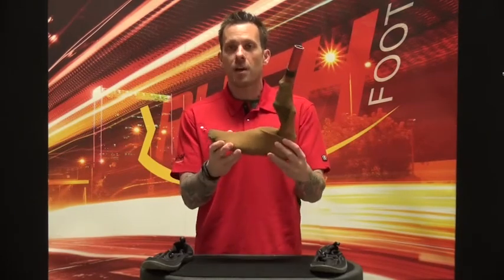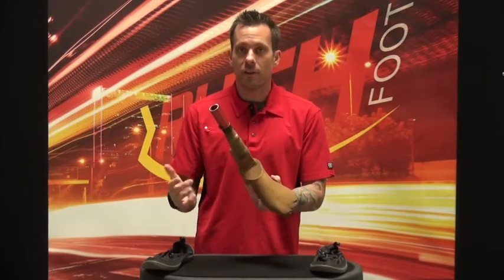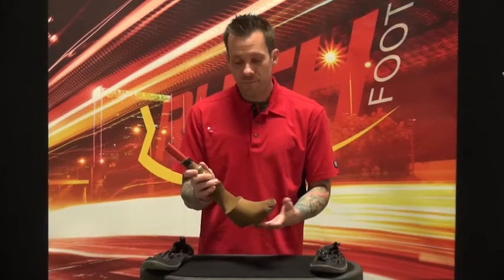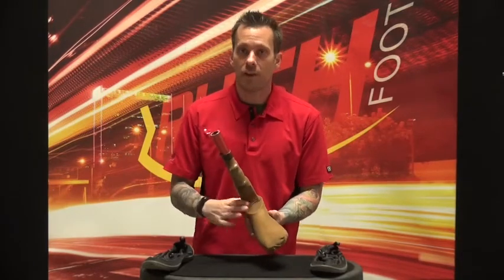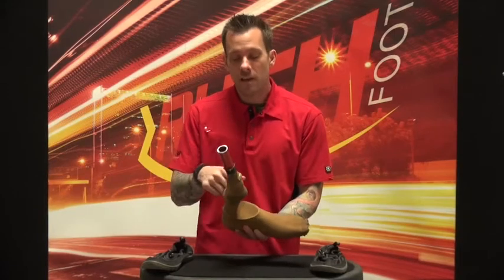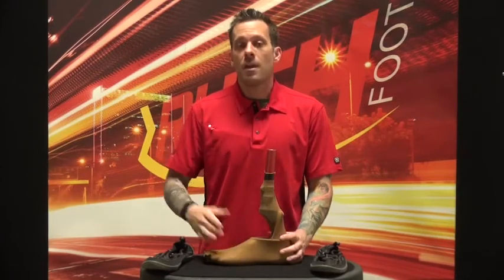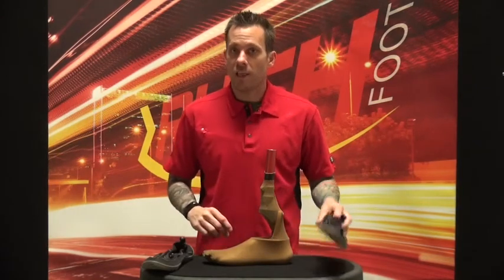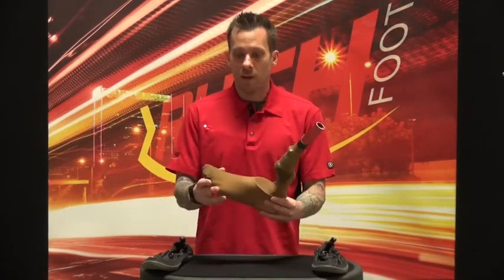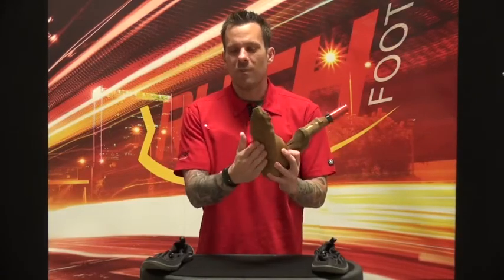Now that I've taped it to the pylon and cut off the excess, what I've done is created a huge sock basically to go over my prosthetic foot. You can see it's covering up the foot shell, so if I go wading into the water at the beach, I'm not going to get rocks, sand, debris, or anything else down inside the foot shell. When I'm done with my day at the beach, all I have to do is give the foot a fresh water rinse and life is good.